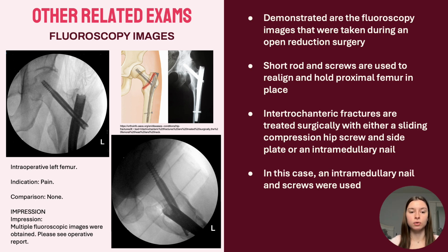And these fluoro exams are crucial for guiding the placement of these surgical implants to achieve proper fracture reduction and stabilization. And then I do have a reference image here that kind of shows the intramedullary nail and how it goes down to the mid-femur, but in some cases it may go all the way down to the knee. And then here are the fluoro images of my patient. So you can see that intramedullary nail, a rod, and then here's a screw that goes into that femoral head to kind of keep that fracture in place.